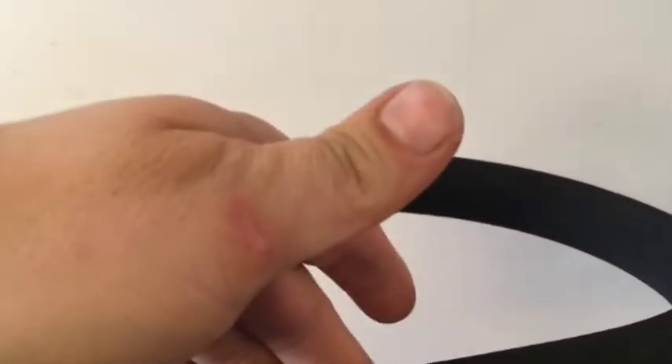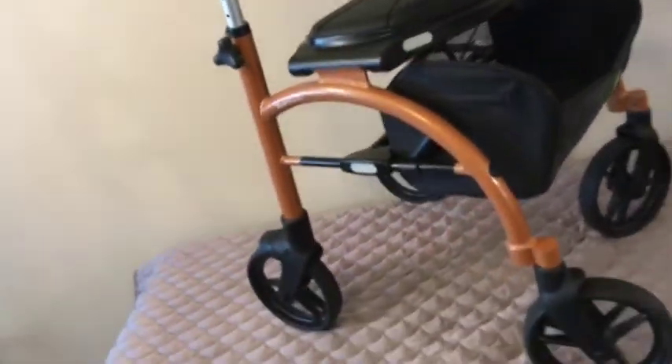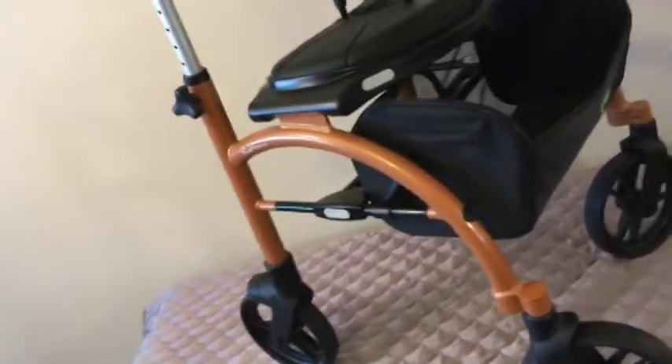Pretty handy. The backrest cushion is perfect and it's nicely padded — you can adjust this as well. And of course there is the accessory basket where you can put all your stuff, and the basket folds nicely with the unit, so you don't have to jumble around with a metal basket.